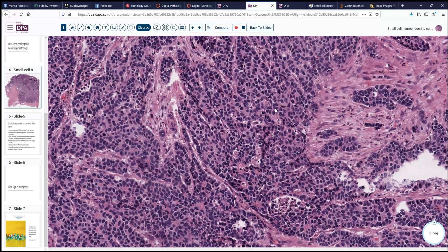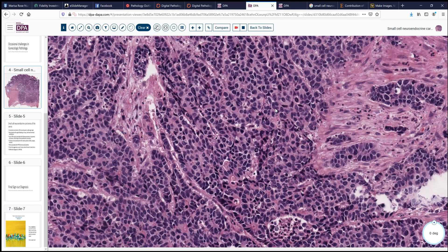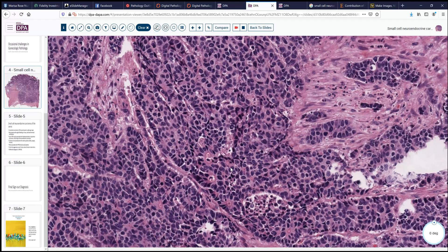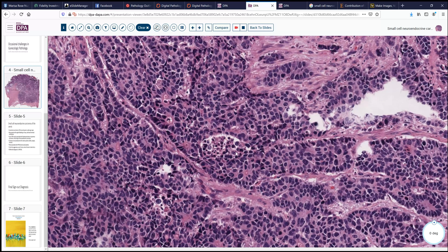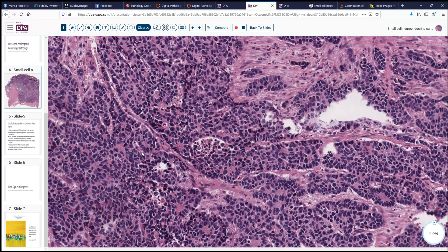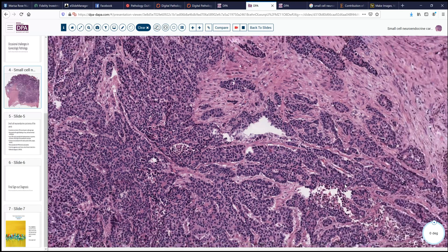Here we see just very high-grade tumor. Notice that the nuclear pleomorphism has increased, the cells show more apoptosis, there is necrosis of more tissue cell areas, and we begin to see a little bit of nuclear molding in some of these cells, suggesting some potentially neuroendocrine type differentiation, which is a little bit unusual.